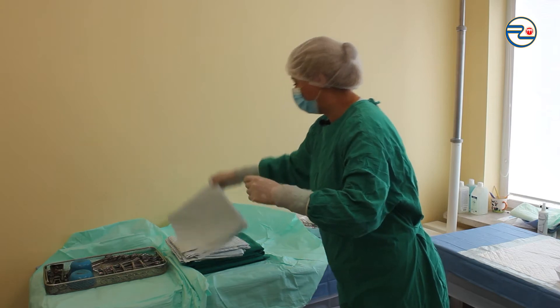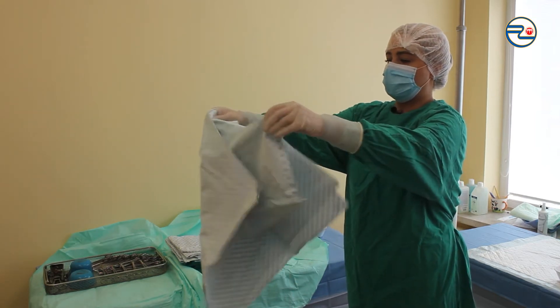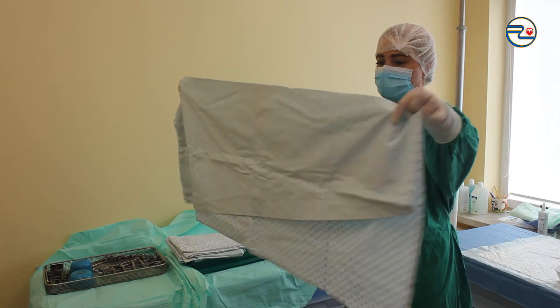I'm taking only one drape at a time. Touching drapes as little as possible, grabbing the drape only on the corners and not waving with it.